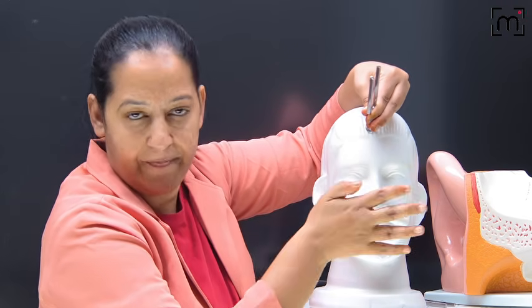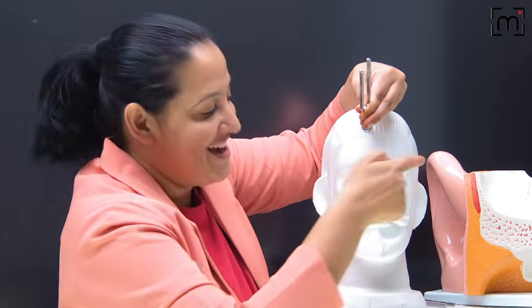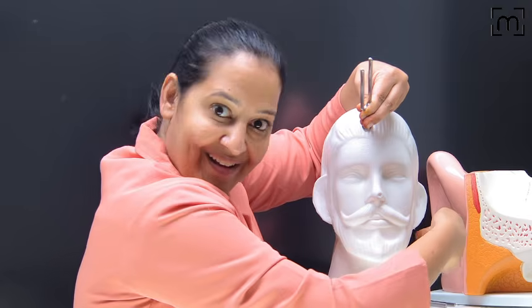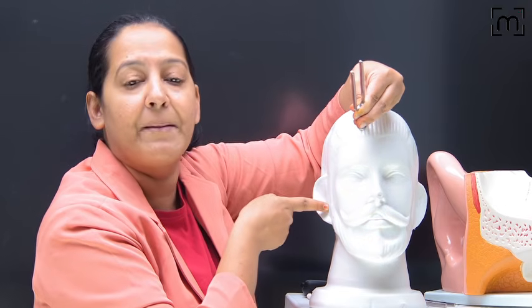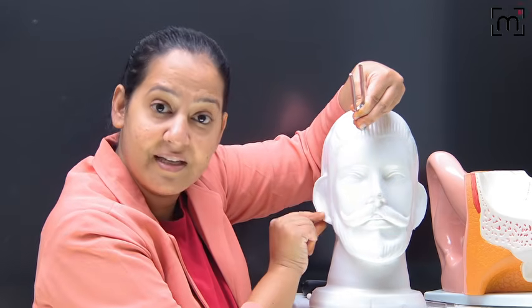They should be equal, Weber should be. But since there is a conductive defect or wax here, the background noise of the air conduction is not going. And here, since there is no conductive defect, the background sound is going. So ideally the waves are equal, activating the mastoid on both sides equally. But since no background or ambient noise is going here because of the conductive defect, for example wax, and here background noise is going, it is better heard on the diseased ear.